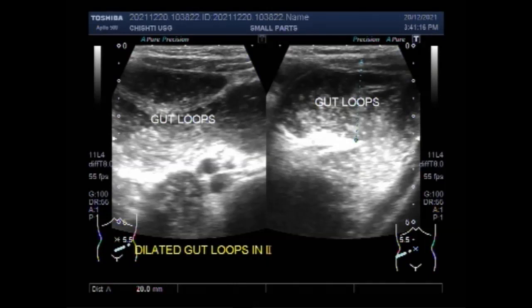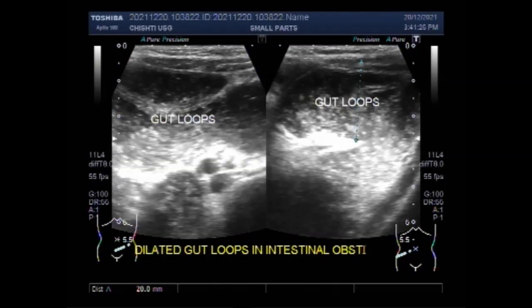In patients with small bowel obstruction, the supine view shows dilatation of multiple loops of the small bowel with the paucity of air in the large bowel.